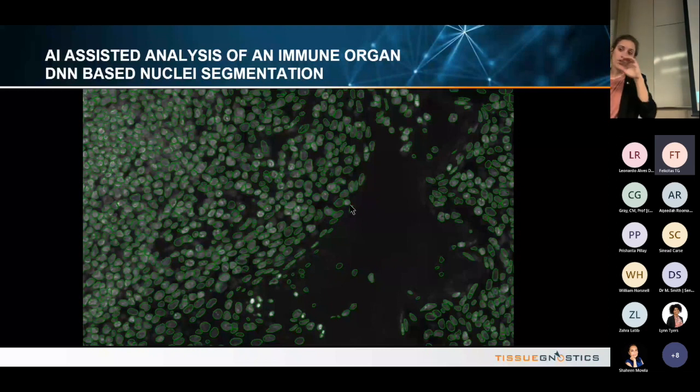And maybe also to mention that when you use the classical nuclear segmentation algorithm, usually you still have to set some parameters. But with the deep learning one, it's basically just loading and running it. So it's much easier, I would say. Yeah, here's just again some comparison.